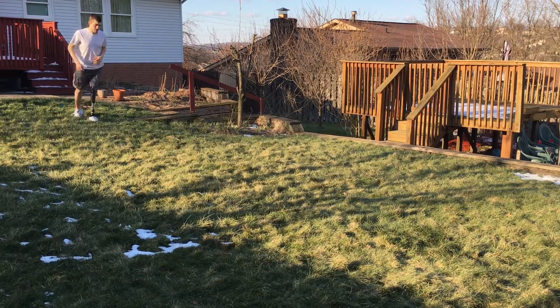As far as running is concerned, this knee actually works pretty well. My first video ever on YouTube was me running on the original Rio Knee — that blue brick that was kind of ugly — but this knee is a beauty, let me just say. Running on this knee is pretty good and it helps when you have a decent foot to go with it. I tested out a variety of five feet and it worked pretty well on most of them. This mode isn't something you want to use all the time, but if you need to catch a bus or jog quickly to get somewhere, it works and it works well. There's nothing you have to do to activate a running mode per se — it's just that there are extra safety features built in to prevent the knee from giving out on you while running.